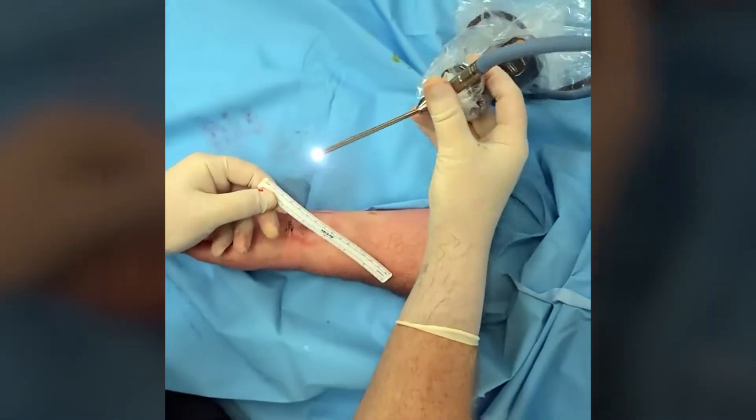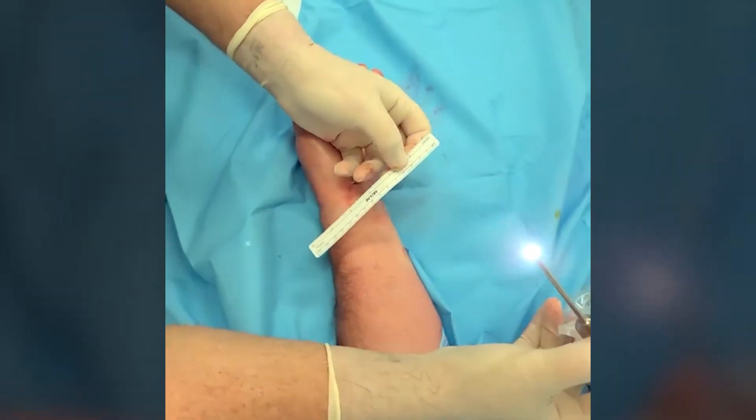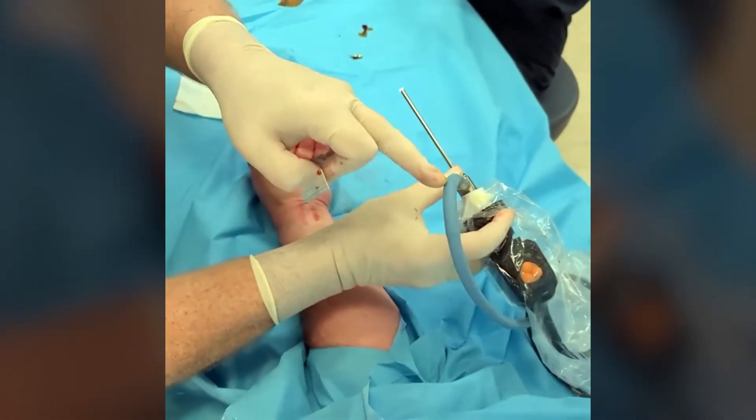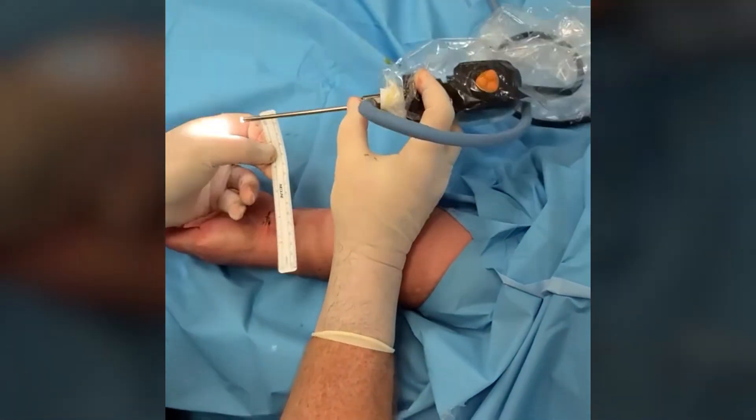This is the endoscope we use for a carpal tunnel endoscopic release. There's a little light on the end that's fed by a cable, and we see through this fiber optic on the television.